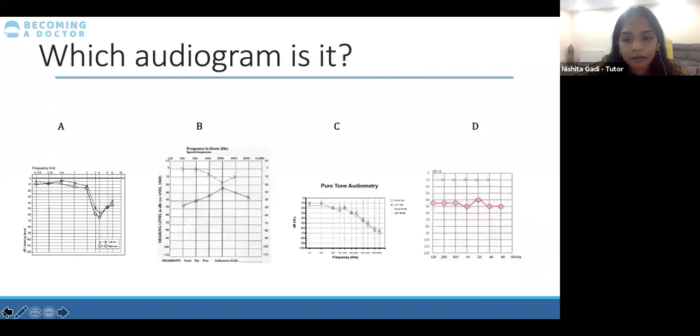Oh, and Aksa, you said your internet cut, just to explain: this was the audiogram for otitis media with effusion. That's conductive hearing loss, so that's why it's there.